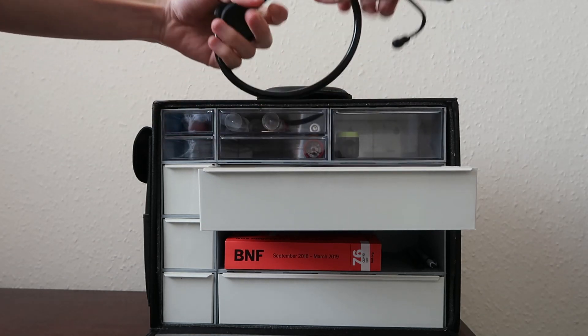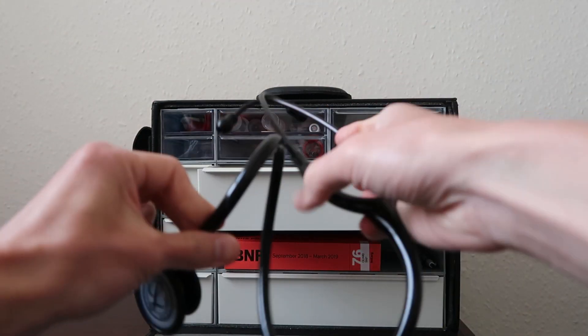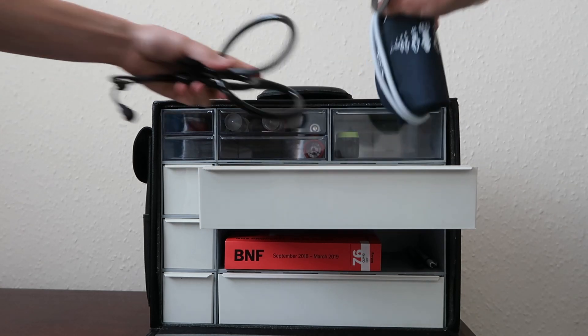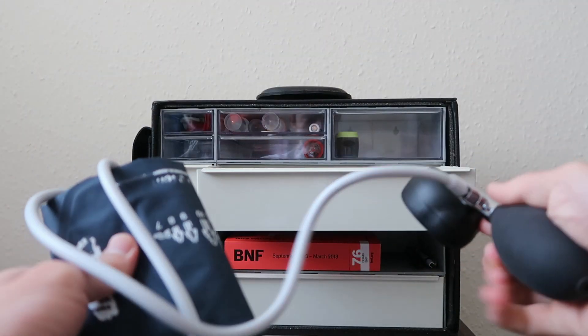In the first large drawer I keep my stethoscope. This is a Littmann stethoscope — I've had this stethoscope since medical school. And then you have the blood pressure cuff and monitor.